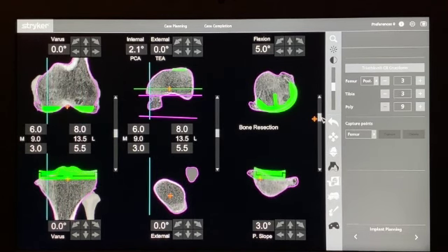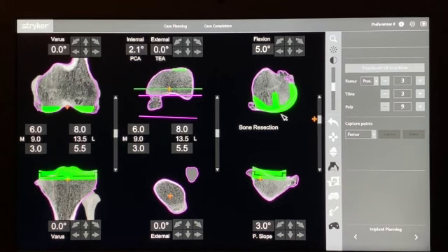So we can see here that this is the femoral condyle, and here the purple line is the bony anatomy, and the green is the prosthesis. So this prosthesis is sticking out. It's just a couple of mils proud, both distally and posteriorly, which is probably a fraction too much. So you might tuck this in a little bit. All right, and this would allow for the normal amount of articular cartilage beyond the bone model.